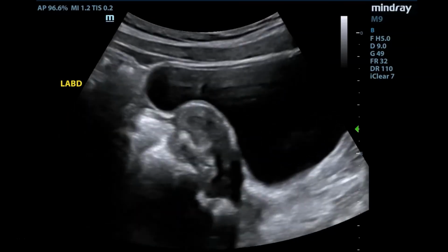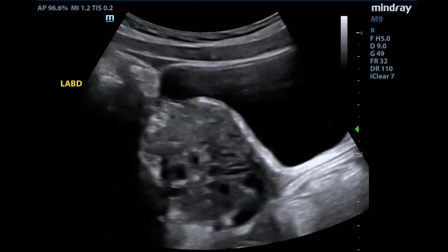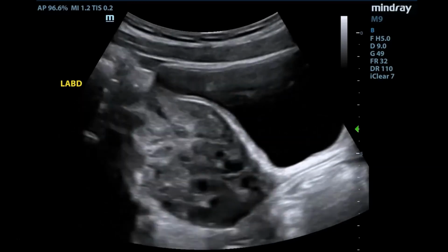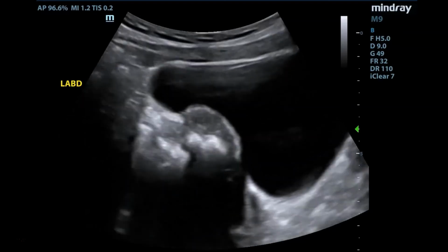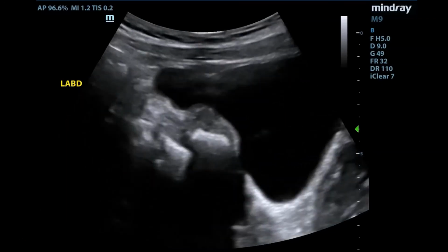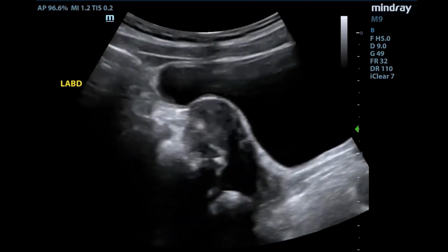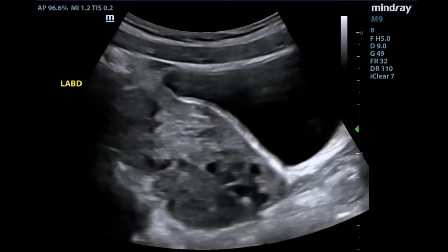That first structure you see is her uterus, which is appropriately small, and then there's this very large ovary. Now that would typically make you concerned. If you see a unilateral large ovary, and you'll have to take my word that on the other side they couldn't visualize the ovary at all, that should make you very concerned that there is a high risk of there potentially being a torsion. There are advanced things you can do, looking for flow with color Doppler, putting on waveforms, measuring the speed of blood flow, but all of that is essentially beyond our purposes for this conversation.